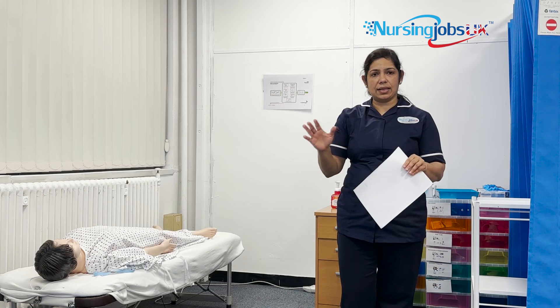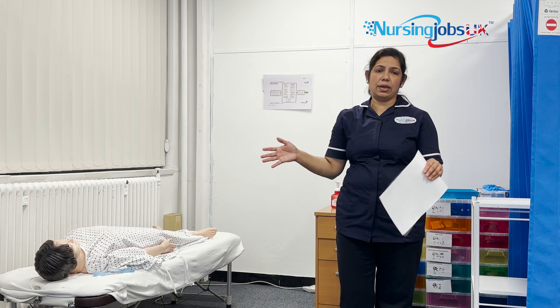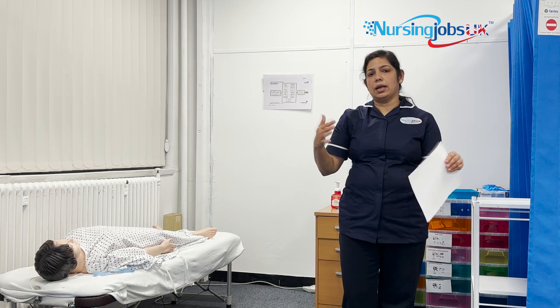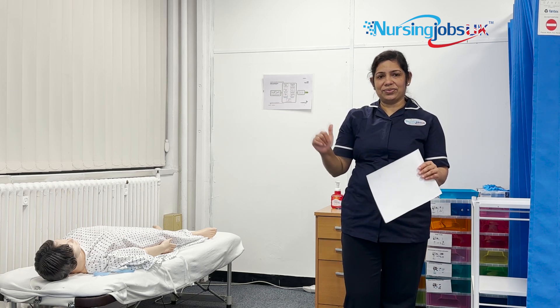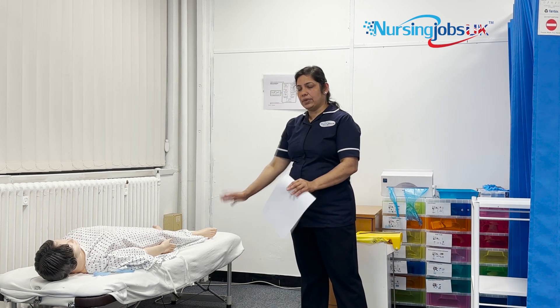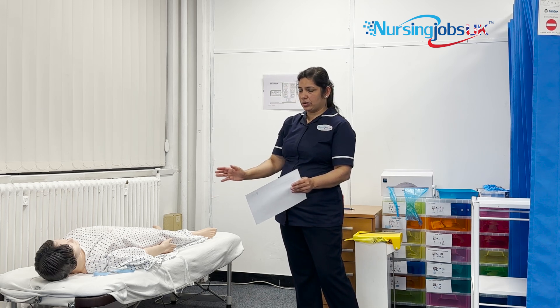If they say the ID check has been completed, you just need to think about which steps remain. If only the ID check has been completed, you start from the rest. Scene safety, hand gel, ID check, allergy check, and pain check are completed. I'm starting from explaining the procedure.